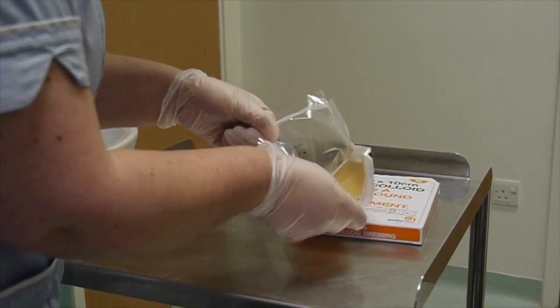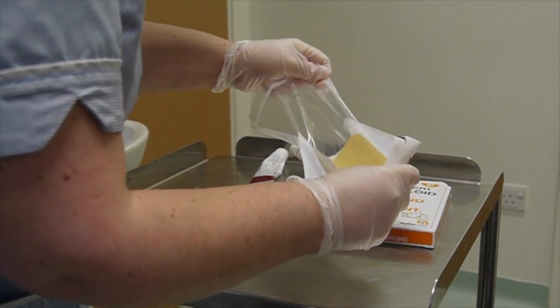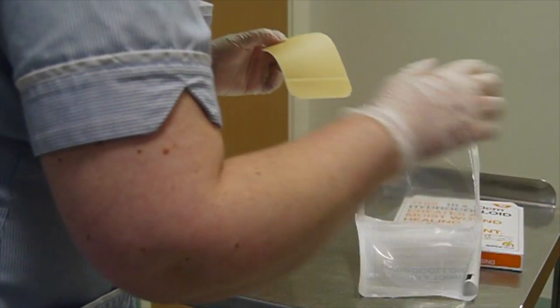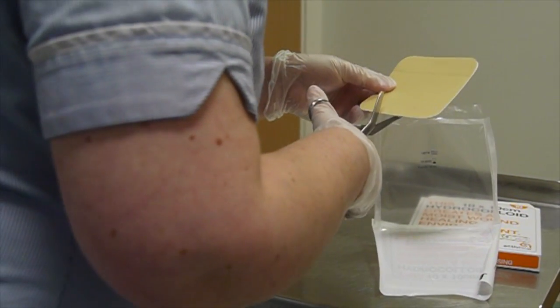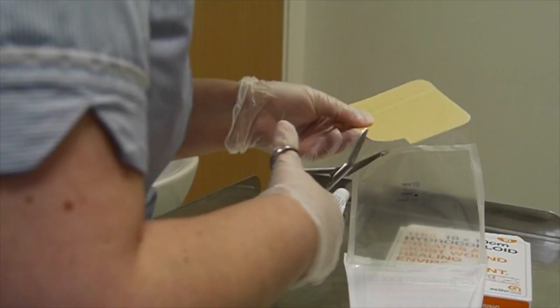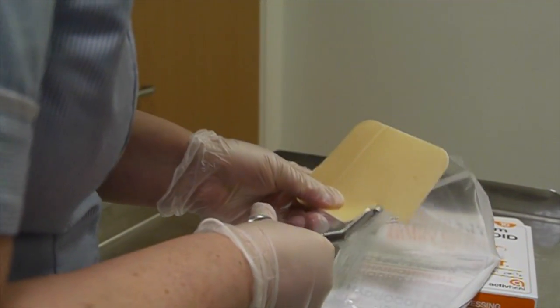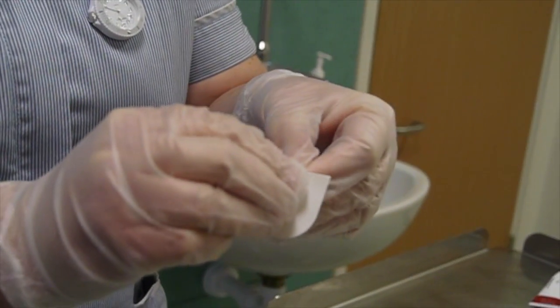The dressing packet is opened and using a pair of scissors a piece of hydrocolloid dressing is cut so that it will cover the small patch of eczema and also overlap it by about half a centimeter all the way around. If this isn't done then the hydrocolloid obviously won't stick, because there's not enough skin for it to stick onto.